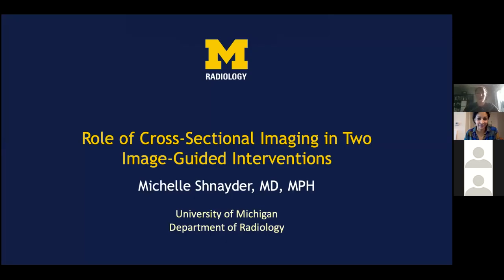All right. So this presentation, I have about 10 cases that I put together for a conference that I'm going to be giving tomorrow at my university. I forgot to mention, I'm a resident at the University of Michigan in the interventional radiology program, and Artie is a mentor of mine, so she pulled me into this situation here. So I'm going to talk about the role of cross-sectional imaging in image-guided interventions.